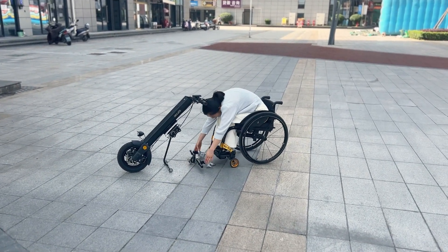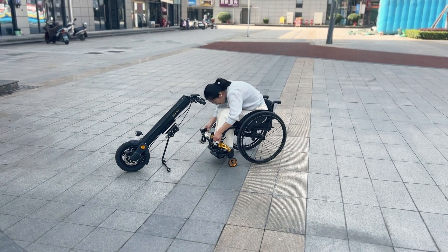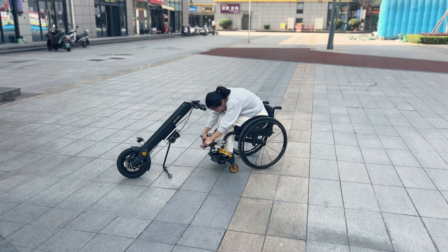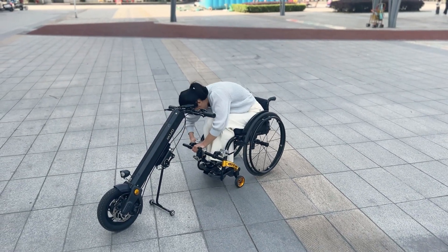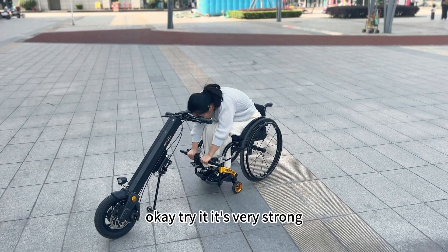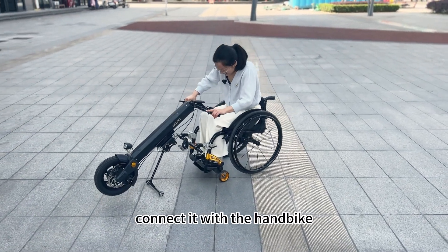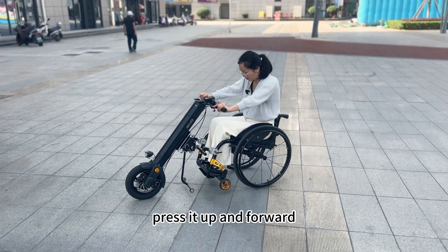Okay, first take this clamp. Turn the button to lock the clamp — it's very strong. And then connect it with the handbag. Press it up and forward.